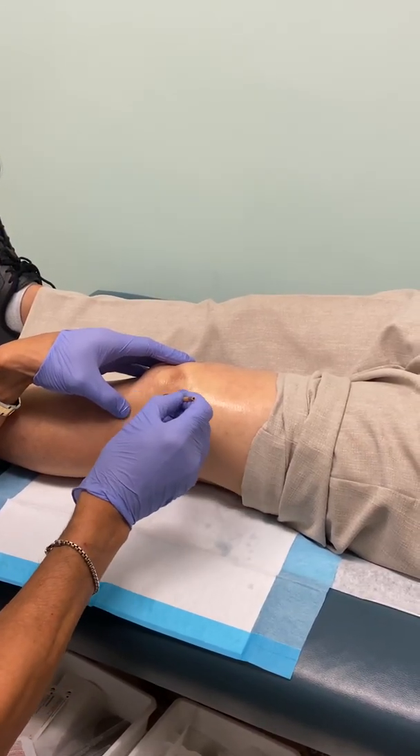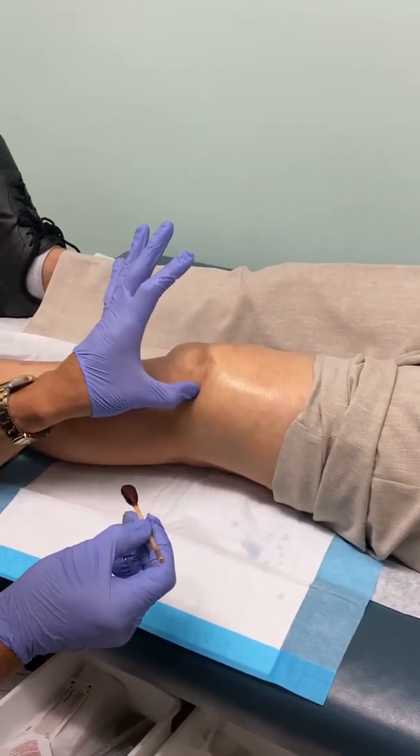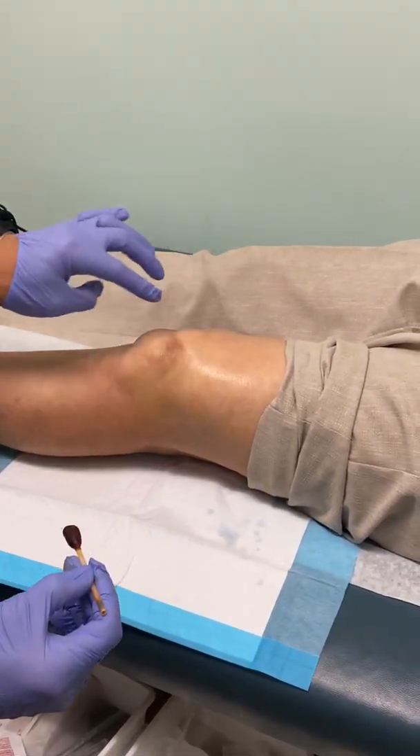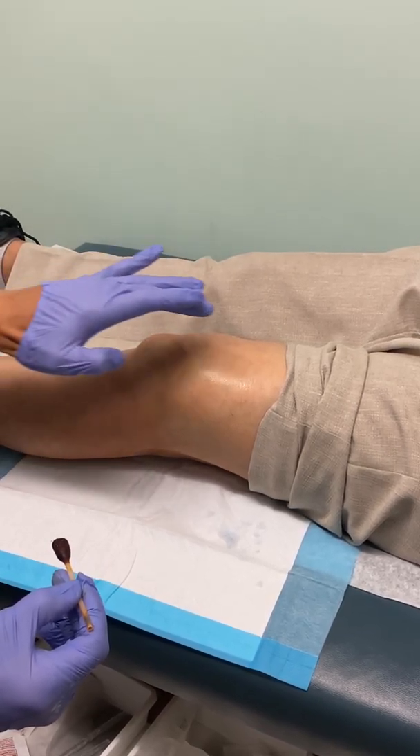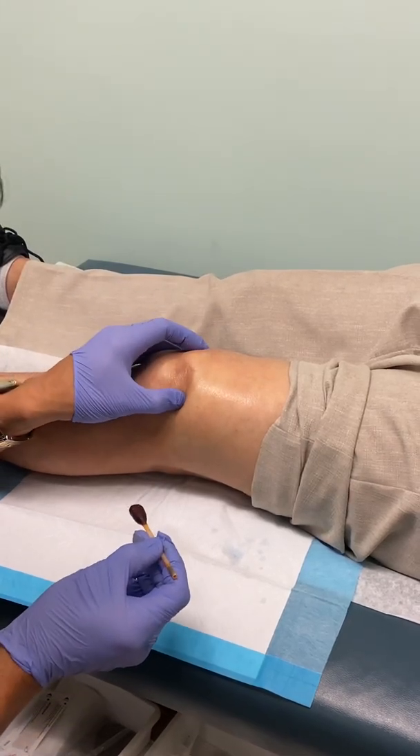So this is what I'm doing here. I'm working off the knee, the kneecap — I'm just feeling the lateral border of the patella. This is the patella, tibia, femur. You can see a big swollen area that's usually an effusion.